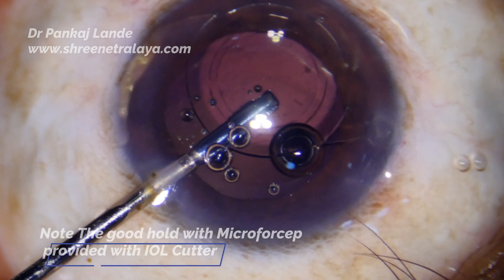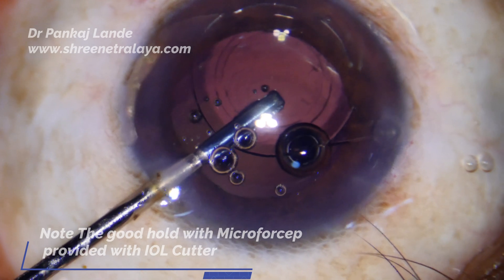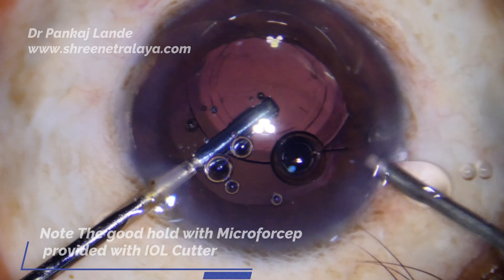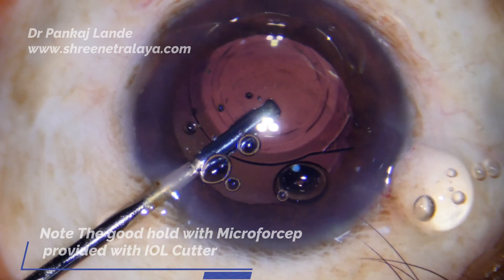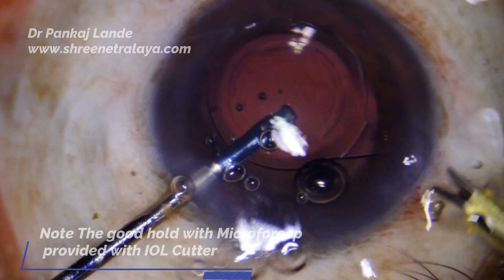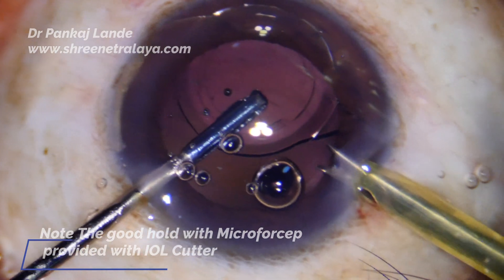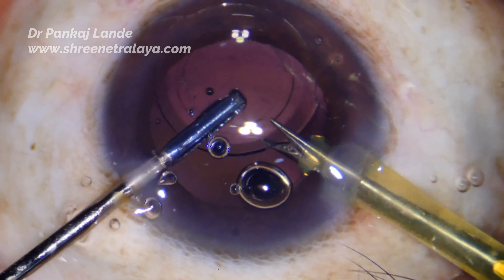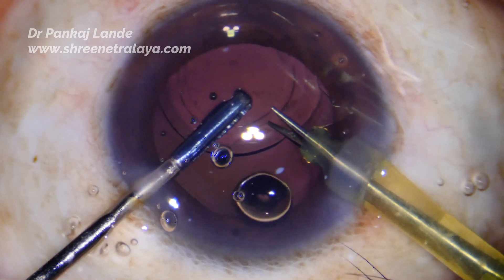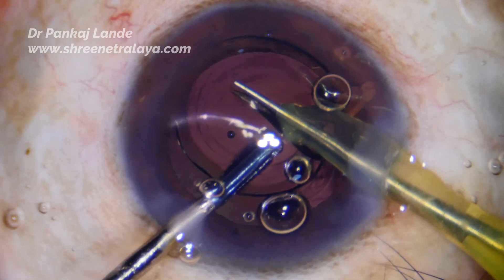Having a very good grip is very important while cutting the IOL, because unless you hold it properly you cannot cut it properly. Fill the anterior chamber with visco and push back the posterior capsule. With power of 30, irrigation on, flow rate of 25, and vacuum zero, I am introducing my IOL cutter — and very smoothly it is going in, holding and cutting through and through.